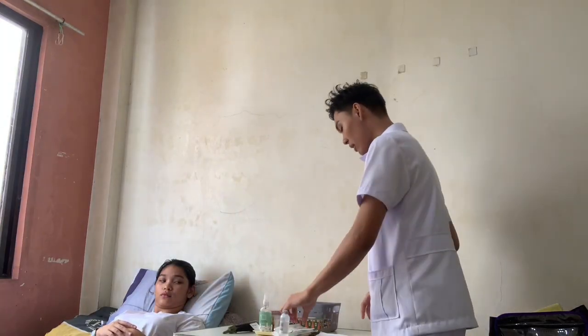So after that, I will ready my syringe. I have here a 3 cc syringe. Since the syringe comes with a needle already, I am going to loosen it first so that I can connect the barrel into the aspirating needle.